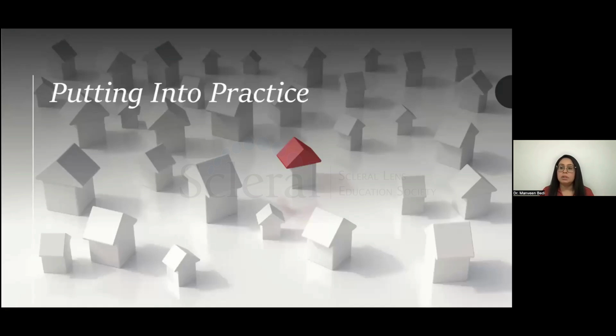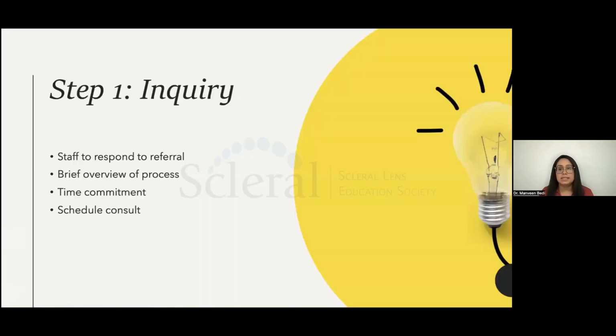So how do we put all the information that we've discussed into practice? The next set of slides are things that I've implemented in my clinic. They're quite detailed, so pick as much as you would like from the slides that we're going to go over now. Step one is the stage when you get a phone call or a referral for a scleral lens fitting. Normally the staff will respond to the referral. The task is mainly to first get appropriate information to book the appointment, and then provide the patient with an overview of the process, and especially the time commitment.